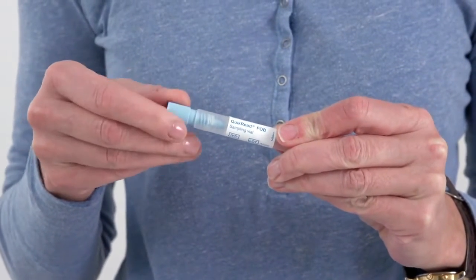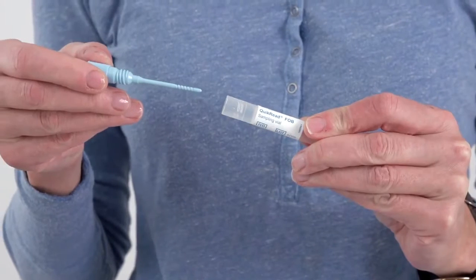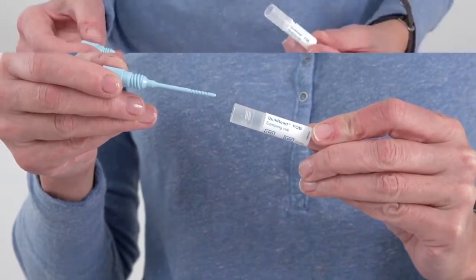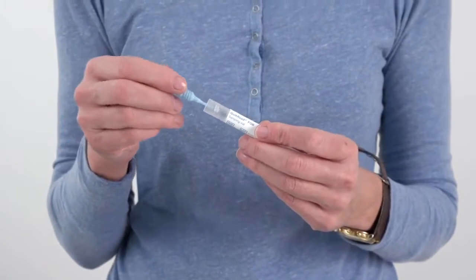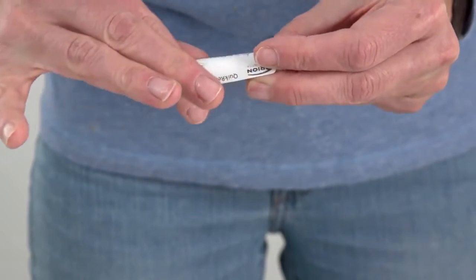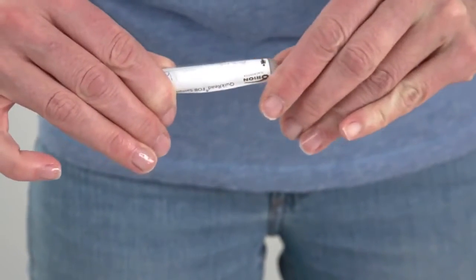Unscrew the top of the sample collection device and collect the sample by twisting the stick in three different locations of the sample. Insert the collecting stick back to its place. Write your name and date on the label and attach it to the sample tube.